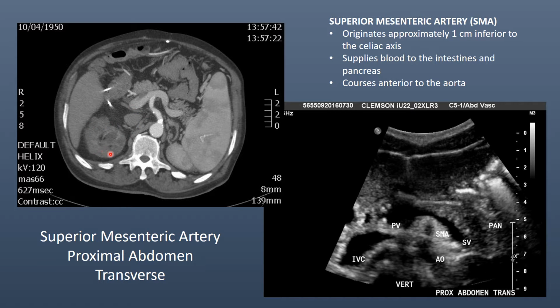I want to point out the right kidney, a portion of the left kidney, a portion of the liver, and we have bowel, some bowel gas. I'm going to move to the ultrasound image. Patient's right, left, anterior aspect, posterior aspect. This portion of the liver here. And we'll go back. We've got the vertebral body with the shadow behind it.